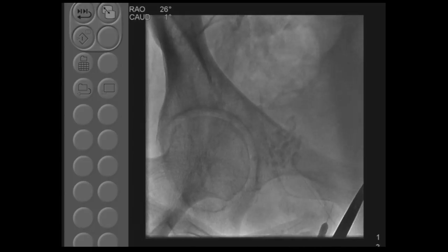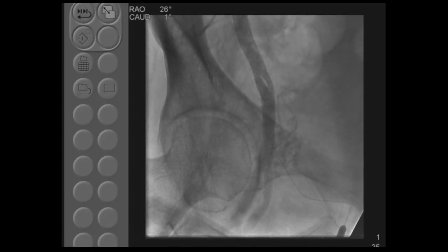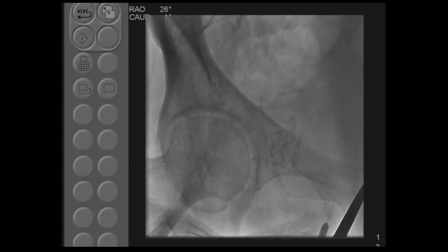Yeah, I think if you can show the groin shot before we do any kind of closure, assist device, we have to make sure your femoral artery and iliac are okay and can take this device. Even if they are calcific tortuous, you are able to do it, but as long as you are very cautious. We have even done this device through an abdominal aortic stent graft.